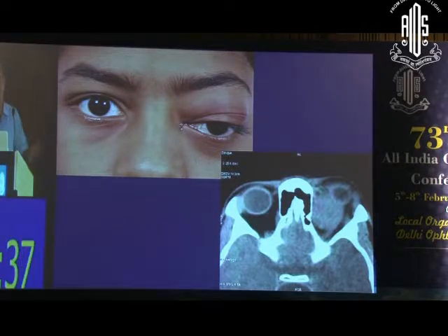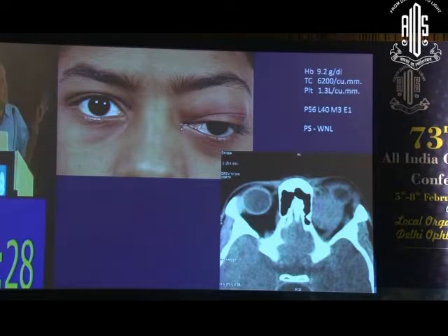What do you think about this one? Again, a pediatric patient. So your differential is again going to be the same, and you would again want to do a peripheral smear with a CBC. Even here, everything was normal except that his hemoglobin was a little on the lower side. Platelet counts were around the lower borderline mark.